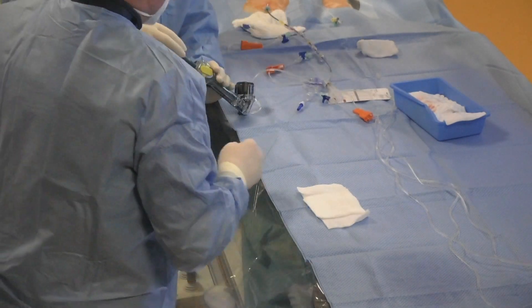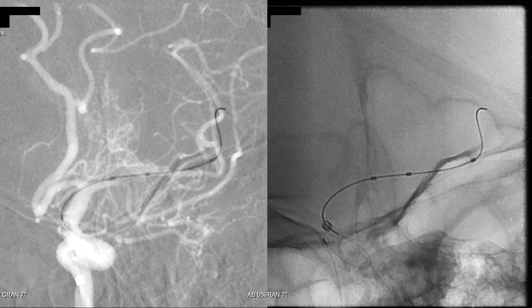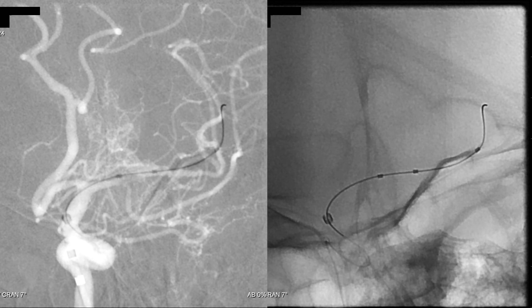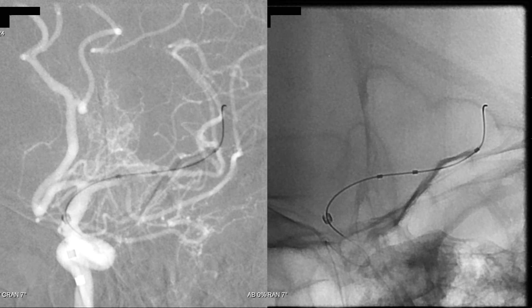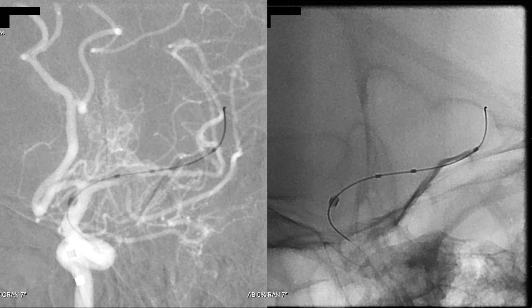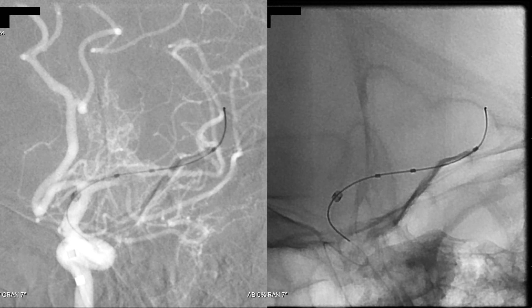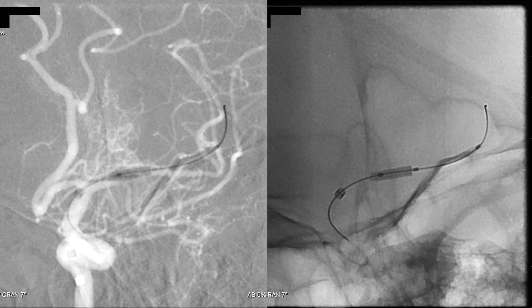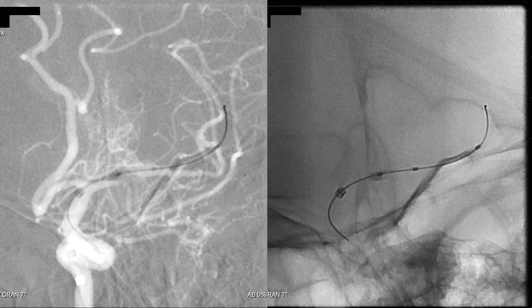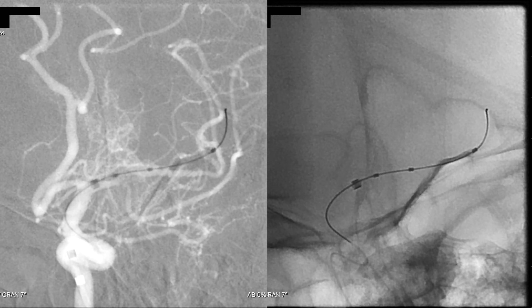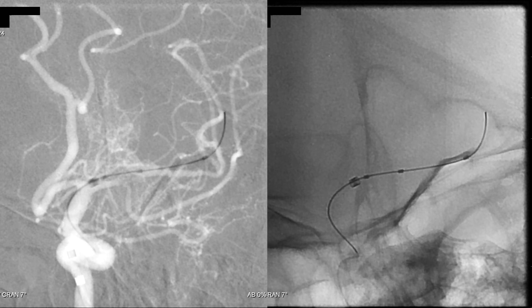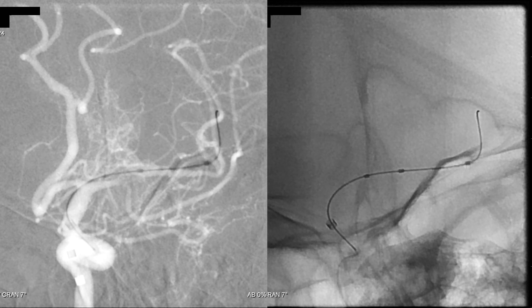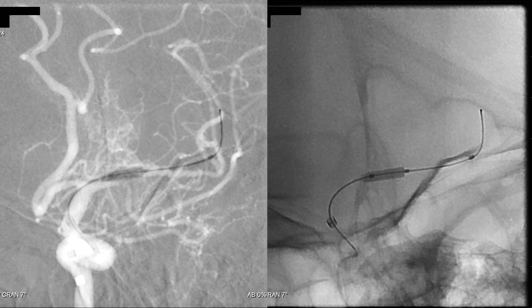Now we perform the PTA, going to 6 bar. Here is the balloon inflated. We deflate the balloon. As you can see, we are a little bit distal to the stenosis, so we need to pull the balloon back slightly and re-perform the PTA to make sure we have properly treated the stenosis.